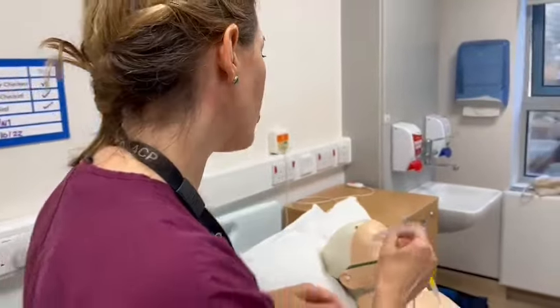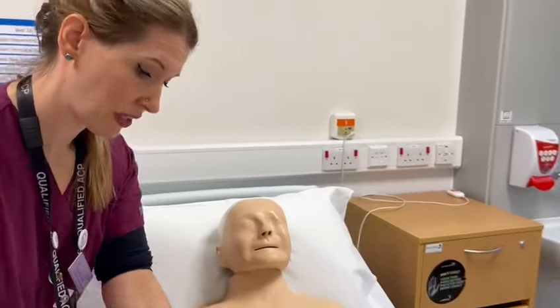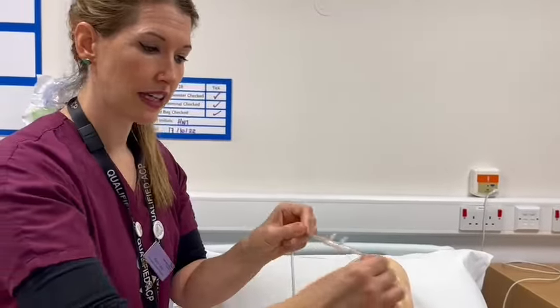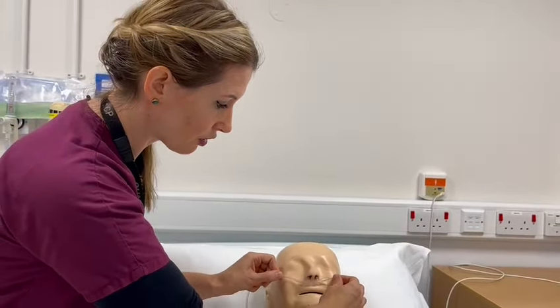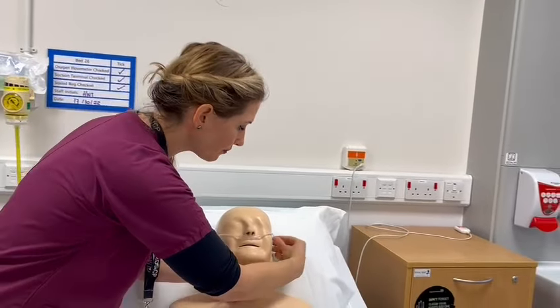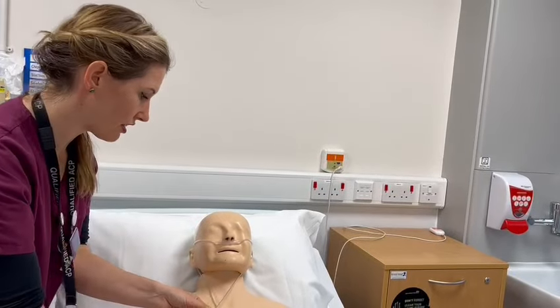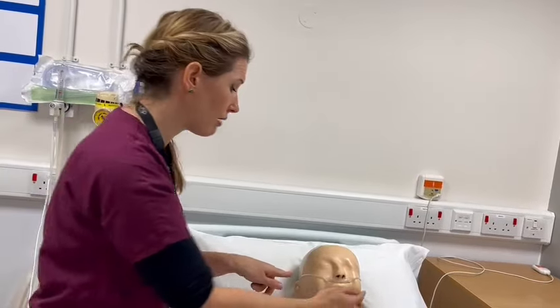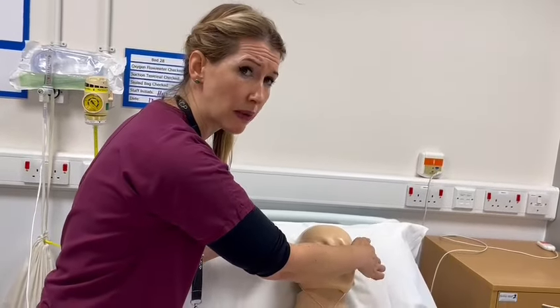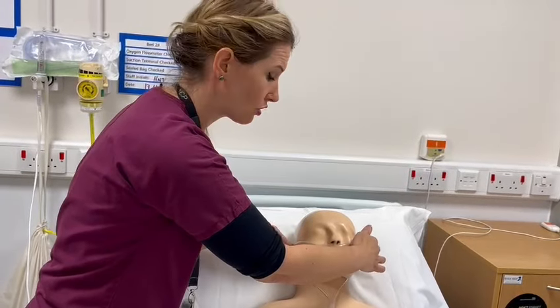I will then come to my patient, explain to them that I'm going to change over to the nasal cannula, and remove the mask. The way this works is it will curl up into the nostrils. So I tend to hook it up into the nostrils and hook behind the ears — there we go — and then just tighten it under the chin. Another thing to be cautious of if a patient is on nasal cannula long term is that they can get little sores behind their ears. So sometimes they need a bit of cushioning, as it's a site for pressure sores.